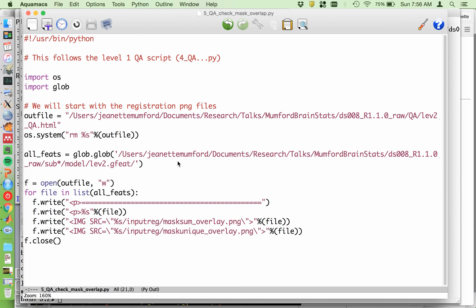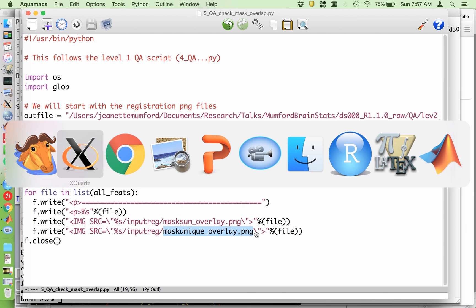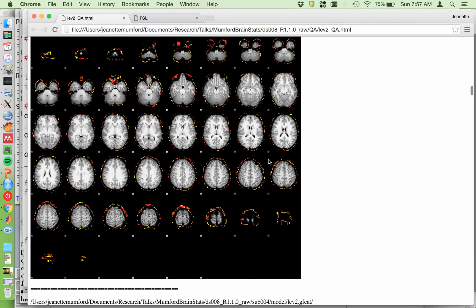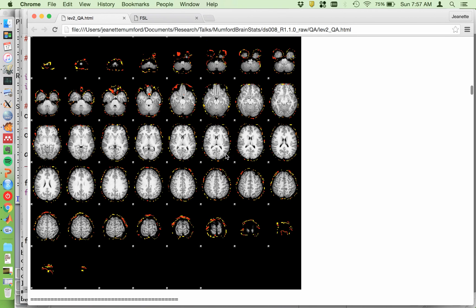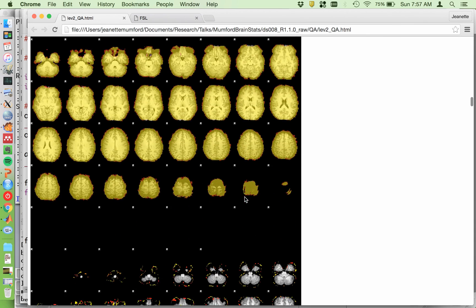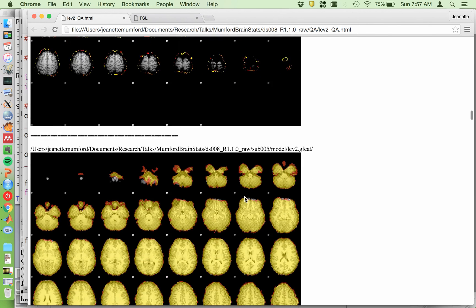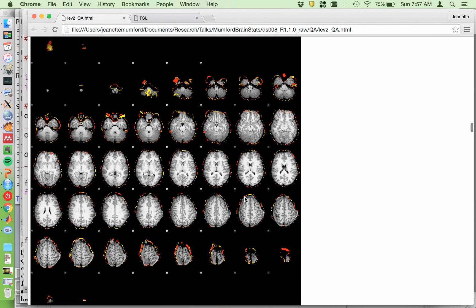This Python script looks a lot like the other one. I now grab all the Level 2 directories using glob.glob, and I'm putting everything in a Level2QA directory. I'm just taking the mask_sum_overlay PNG and the mask_unique_overlay PNG file and dumping it in. Afterwards, you get something that looks like this — now I can just flip through all my subjects and make sure there are no speckly bits on the gray part of the brain. The places where you typically have dropout will be the top of the brain or anywhere where the edge of your slice acquisition range was just a little off for one subject, cutting off part of their brain.